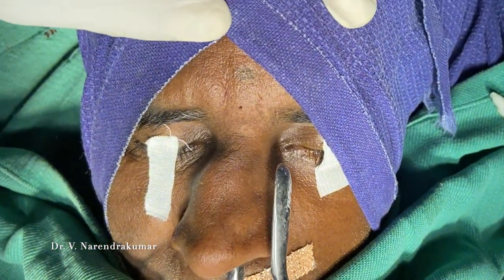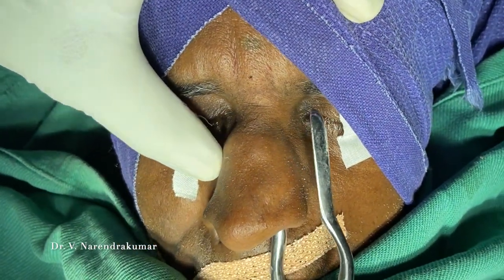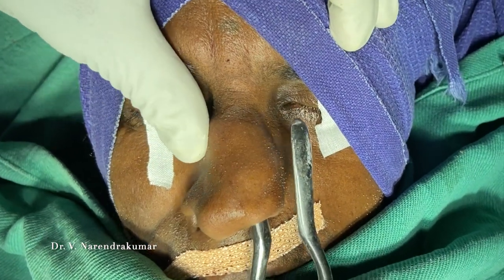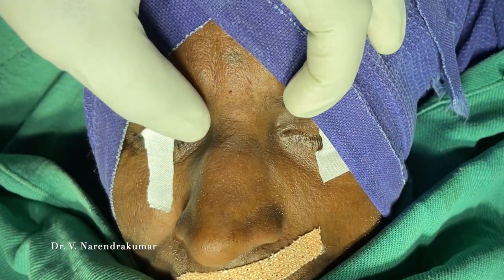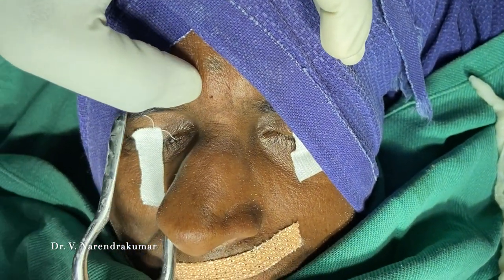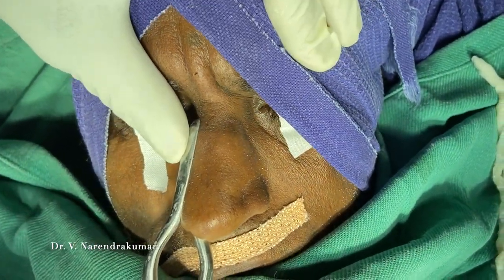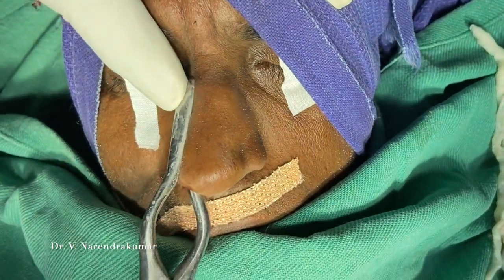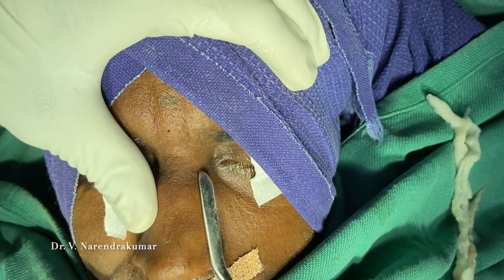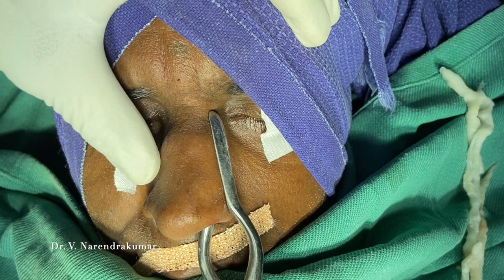Using Walsham forceps, nasal bone reduction is being performed. The impacted bone is released and reduced on one side, and then the nasal bone on the opposite side is also reduced. The reduction is done.